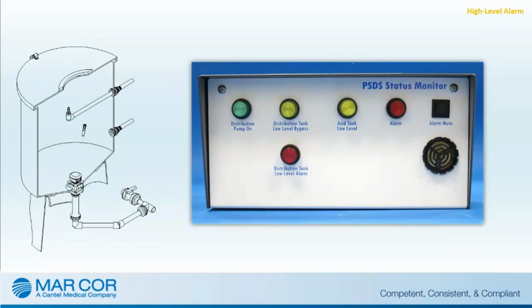The PSDS status monitor communicates a high-level condition with the illumination of a red alarm indicator and the sounding of the audible alarm. Pressing the alarm mute switch on the PSDS status monitor will silence the audible alarm.